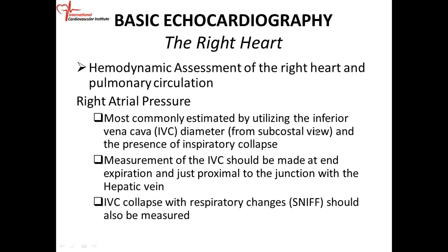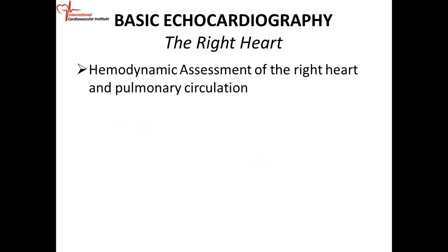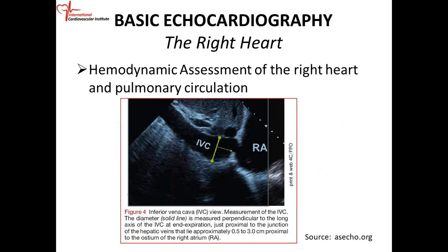The IVC collapse with inspiration: you can tell the patient to take a deep breath in and see. And it's best to do M mode measurements, because you can see what happens with the IVC with inspiration.